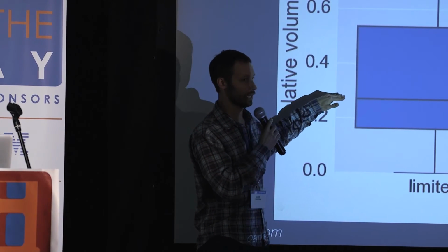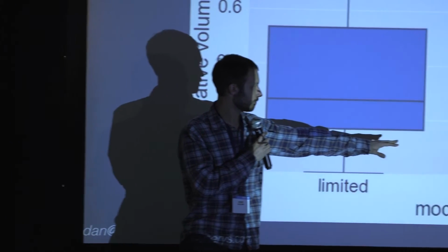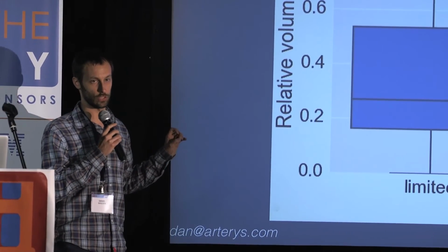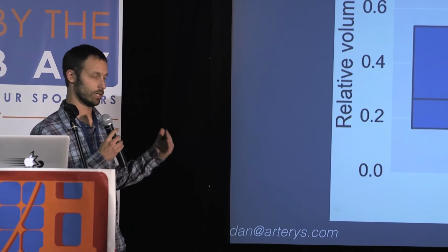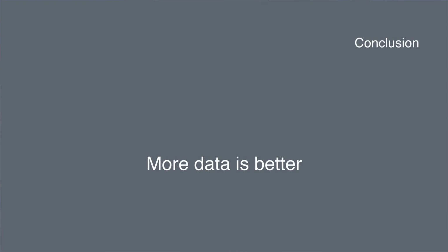30% error in half the cases. And when you go to the model that uses all the data, about 10% error in half of cases. So you've reduced the median error from 30% to 10%, which is really a huge savings. I think it's pretty obvious from this plot that this is a big advantage and is going to work very well.